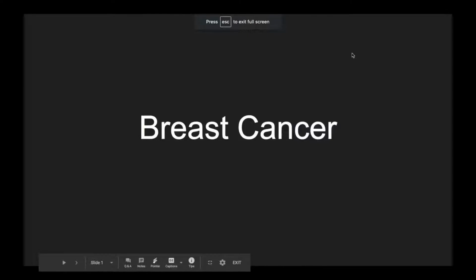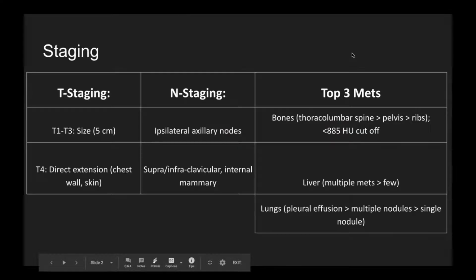Okay, let's discuss breast cancer. Breast cancer is staged using the TNM system, which is found in the AJCC Cancer Staging Manual. Instead of looking at boring tables while I read, I try to include pertinent information in my reports, in theory, that help stage the cancer without actually having the information available. And so, for instance, for this cancer, I use these key facts.